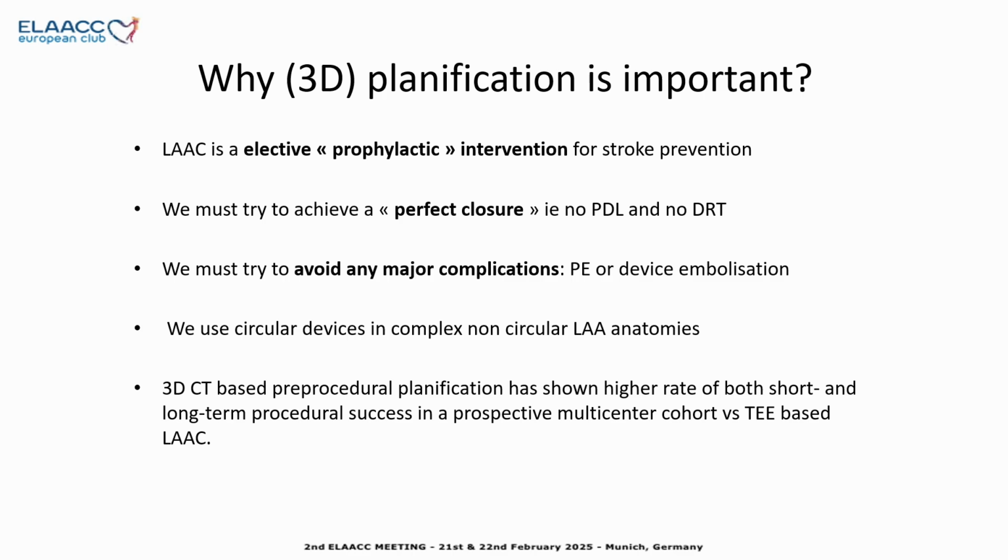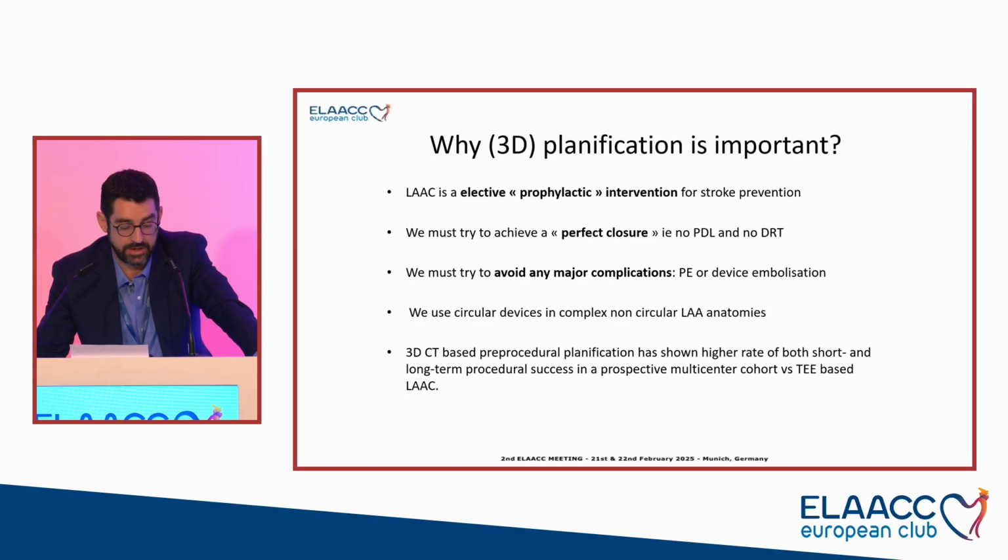So in conclusion, I do think that 3D planification is important for our patients and our procedures, because we must keep in mind that LAAC is an elective prophylactic intervention for stroke prevention.